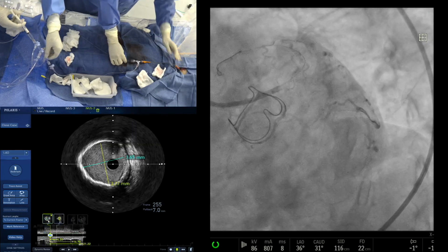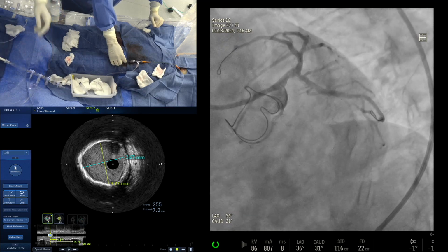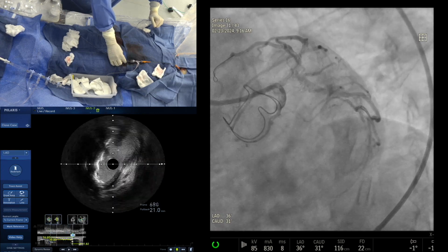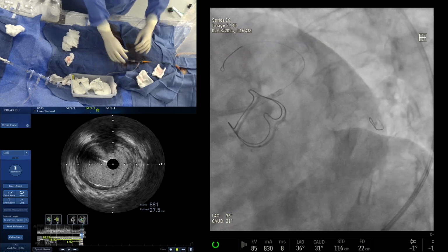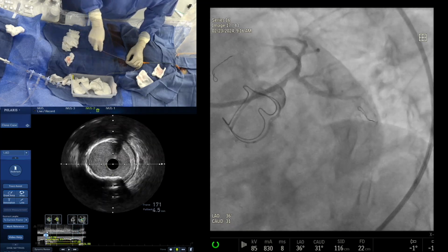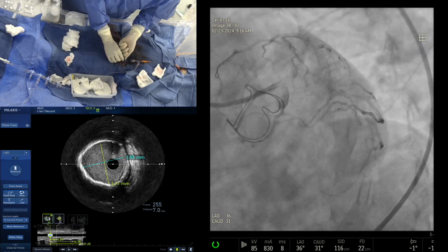Yeah. Good. So we go 3.0. Yeah, the distal left main is halfway. 4.0, 4.0 by 20. What? Left main to LAD. No, left main, there you can use 4.5. Not LAD. Yeah. 4.5 is too big for the LAD. No, you can use moderate pressure. 4.5 by 15 or 16, right? Yeah. No, why don't we use 4.0 and post-dilate to 5.0?